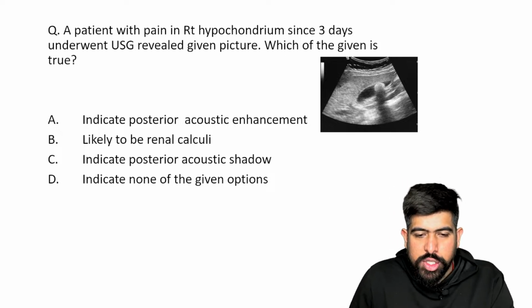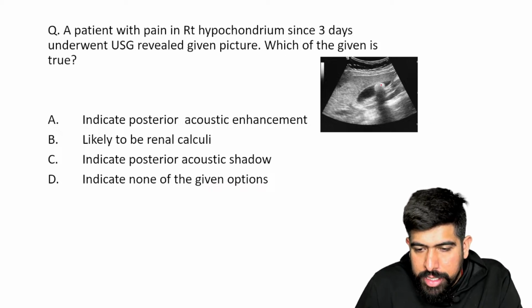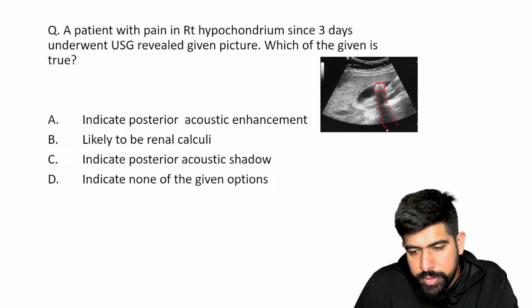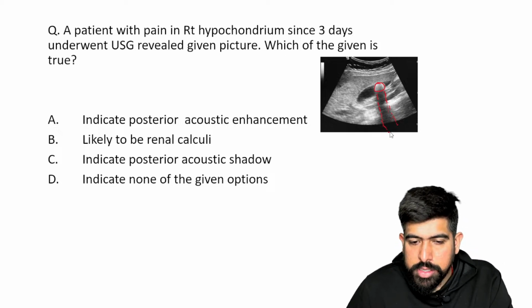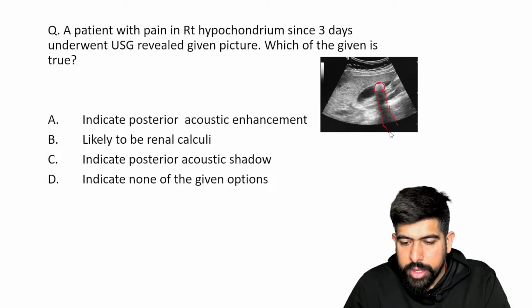So what I'm going to see in this condition, you can see here that something is here. This thing particularly is giving some acoustic shadow also. Can you identify this acoustic shadow? Let me know in the chat box. Can you identify this acoustic shadow which is seen to you?